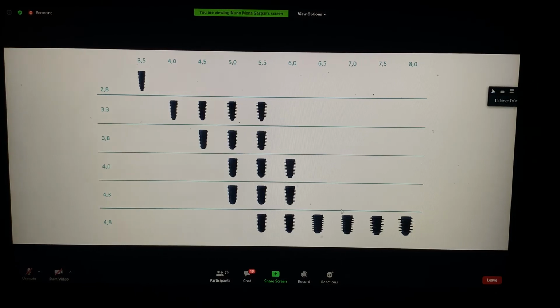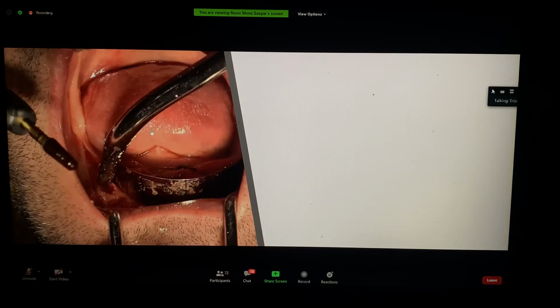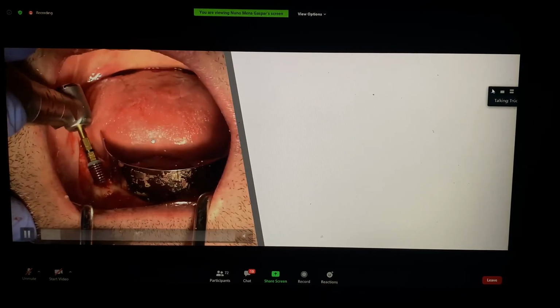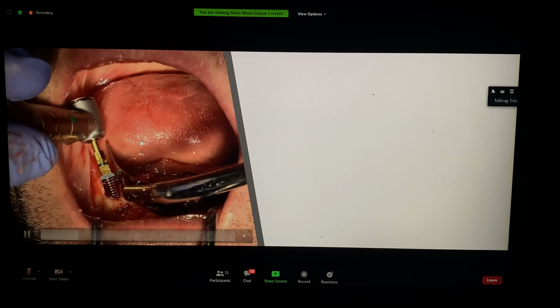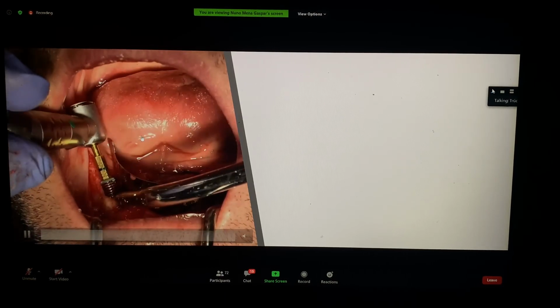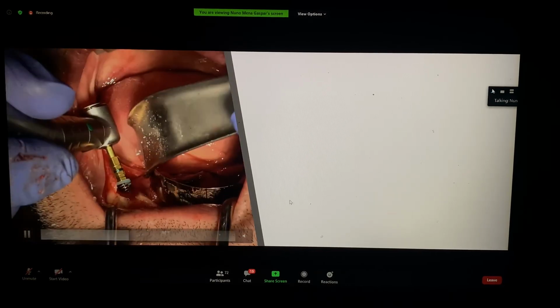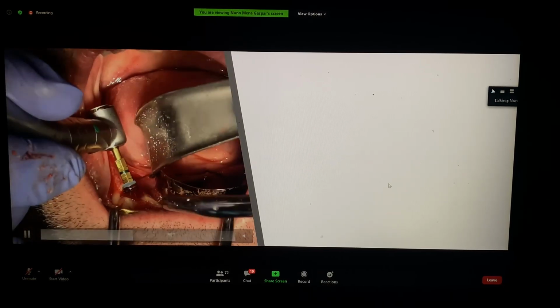Và trong trường hợp này, thay vì khoan thêm nhiều mũi hơn thì chúng ta có thể sử dụng implant Enerich với đường kính lớn hơn. Đường kính lớn hơn tức nghĩa là không phải lõi lớn hơn mà là ren sâu hơn. Okay, and there's the implant placed. I finished it with the torque wrench.